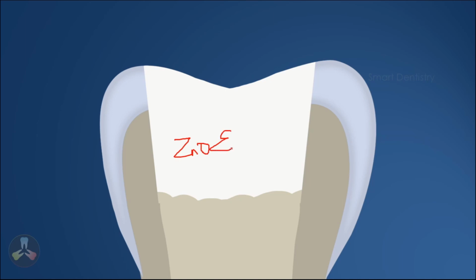But there is a problem associated with all temporary restorations, not only zinc oxide eugenol. Let it be any ready-made temporary cement also. We will be giving a temporary restoration, and the next visit we will try to remove the cement. But it will be always difficult to remove the temporary cement completely. We can always find some of the temporary cement stuck to the walls or the floors and it will never come out. While doing cleaning and shaping, this temporary cement sometimes gets dislodged and it will go and block the orifices.